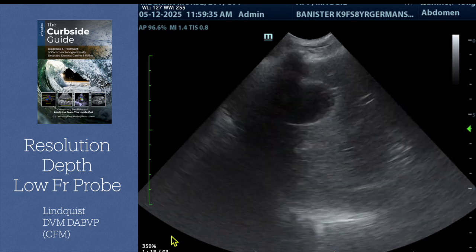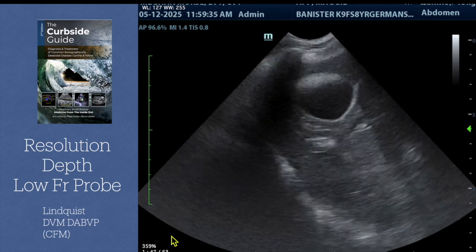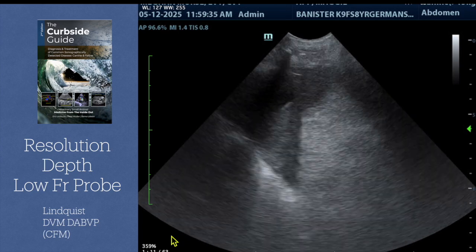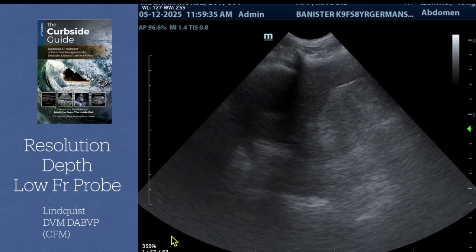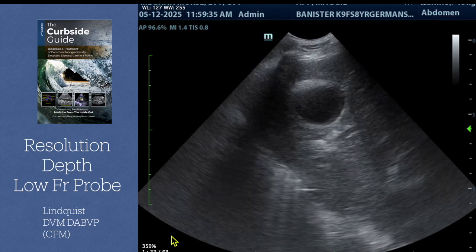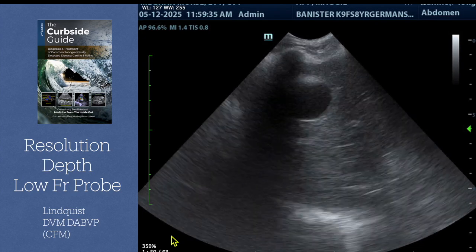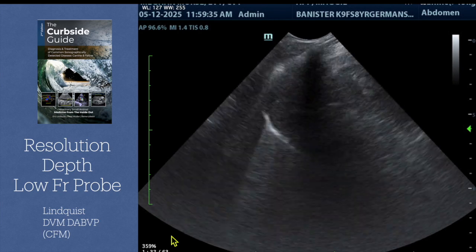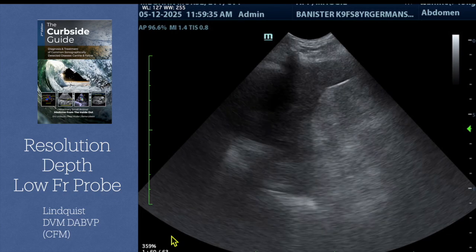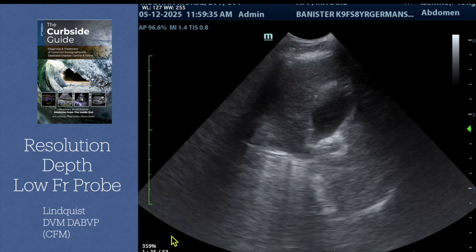But test them out head to head and check off the box with the resolution depth machine. I didn't invent physics. It is what it is. These are experience-based techniques to make sure you make your purchase correctly, that you're going to be happy with, because there's nothing worse than fighting with a machine that is inadequate to allow you to get good resolution depth and telemed out and make your specialist happy, because then they have a 10 to 14 centimeter resolution depth to work with.